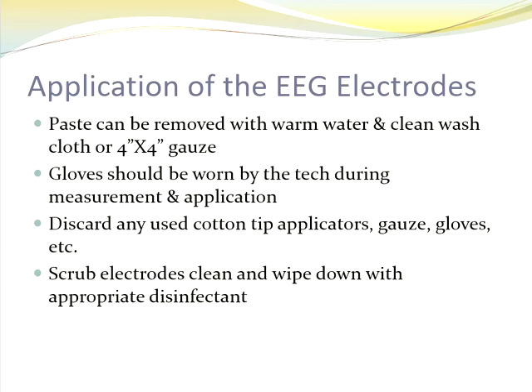And then once we're done using them, we need to scrub them with like the toothbrush, get all the paste actually out of the cup. The warm water helps dissolve the paste out, but it doesn't clean them. You still have to scrub them all, and then you have to disinfect them with like the cleaner wipes that we have back in the lab.